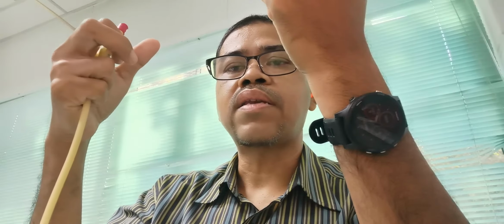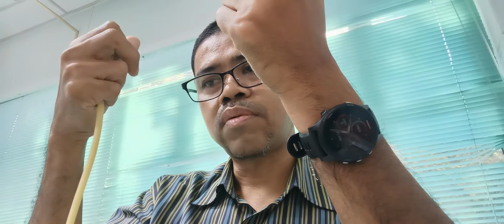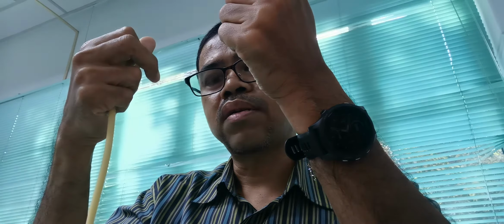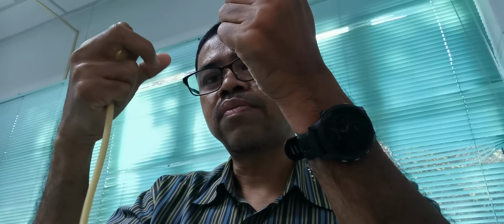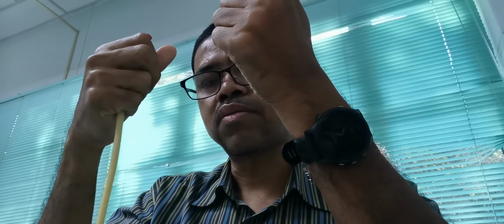Okay, if you fail, you can get the help of the radiologist, get them to perform an ultrasound, see whether the balloon is still distended or not, filled with fluid or not, and then under ultrasound guidance, you can help to aspirate the water, the balloon filled with water for injection. Under ultrasound guidance, we use a needle to aspirate.